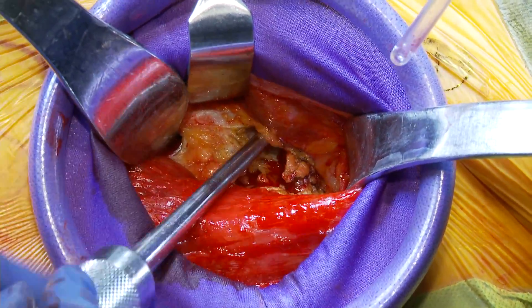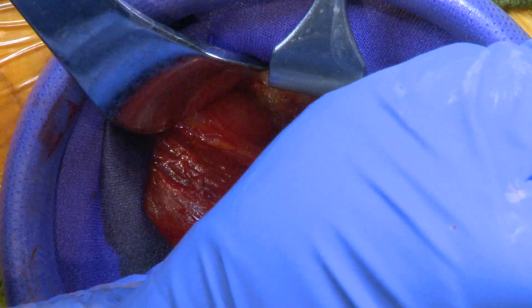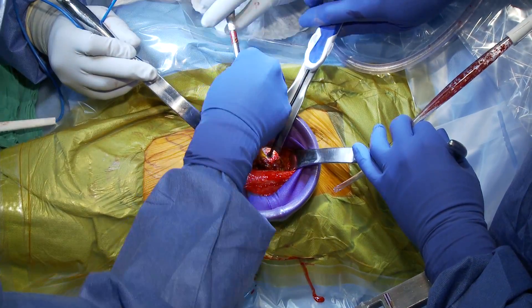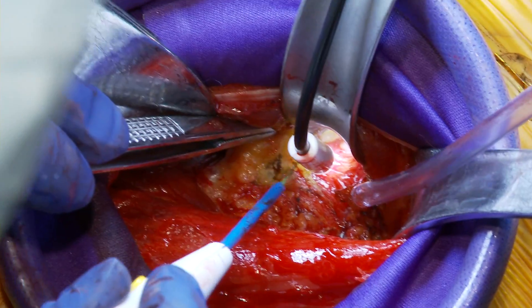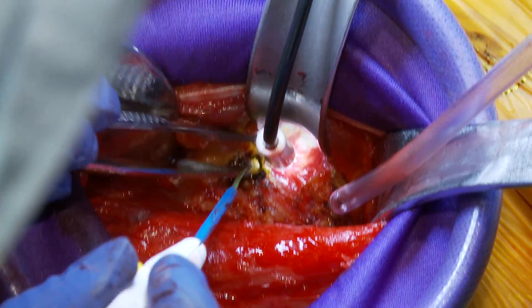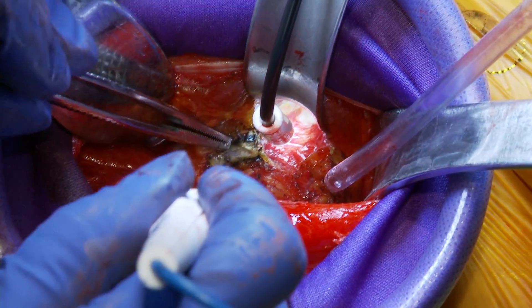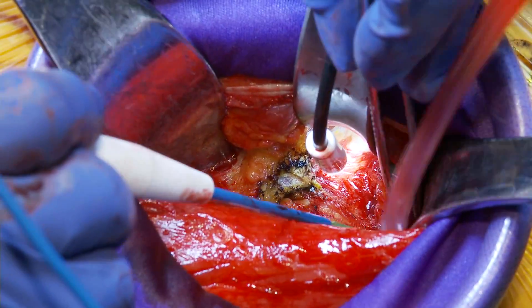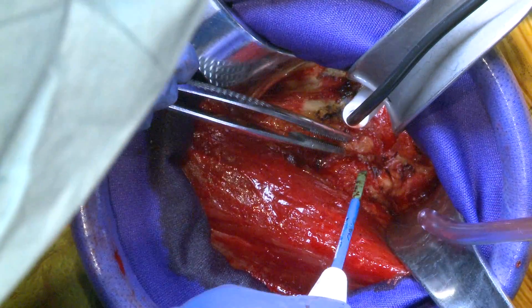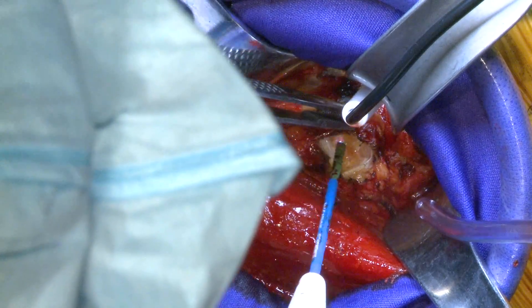I'm dissecting directly on the front of the capsule. It's a small interval, so with the anterior approach the visualization is harder — particularly for the assistants — it's a smaller incision and we're usually working pretty deeply at this point. We have our pre-capsular fat, so we're directly on the hip joint.